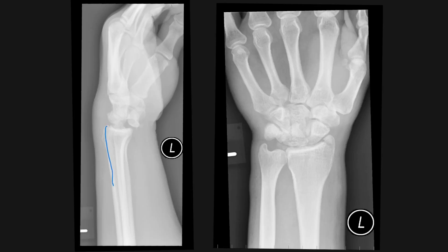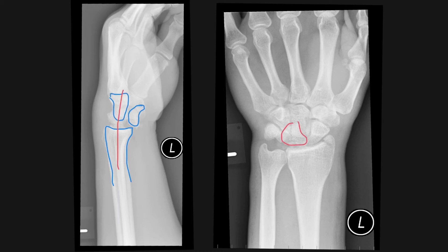In this fourth example we can again see that the distal radius is in line with the capitate and the lunate has moved forwards and is dislocated. When you look at the AP we can see that there is an associated fracture of the radial styloid.